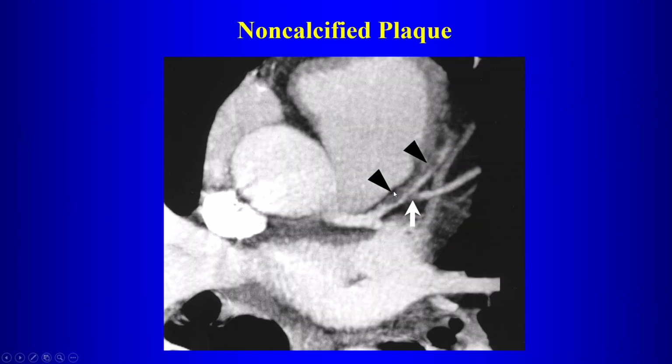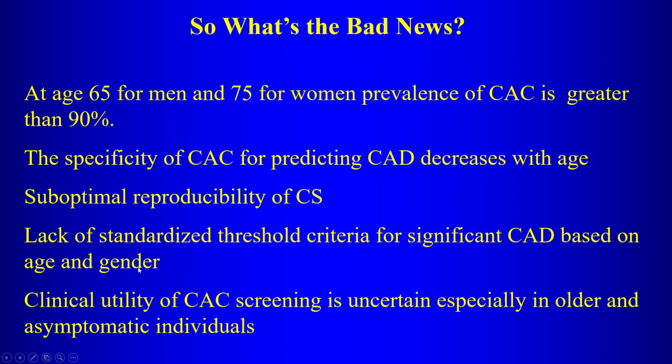So non-calcified plaque, which you can only see with a coronary CT angiogram, this non-calcified plaque is usually the culprit when we're dealing with myocardial infarctions.